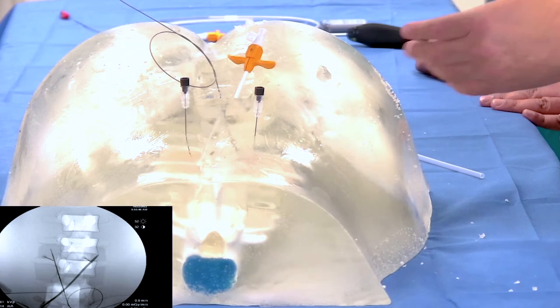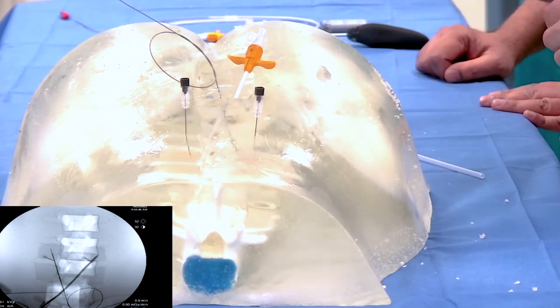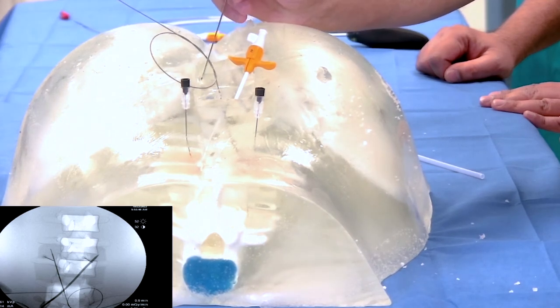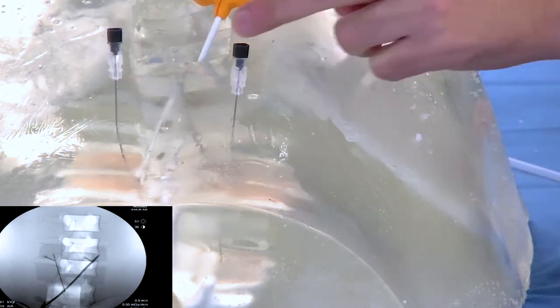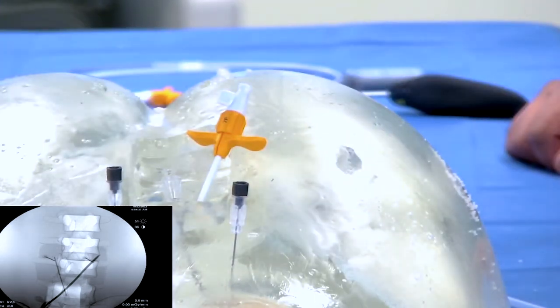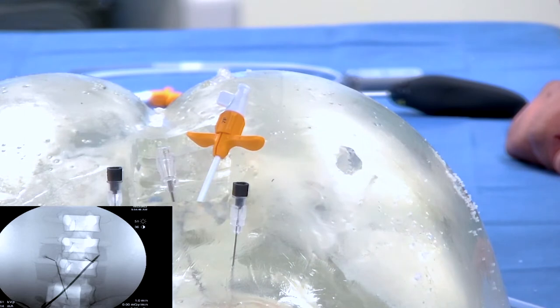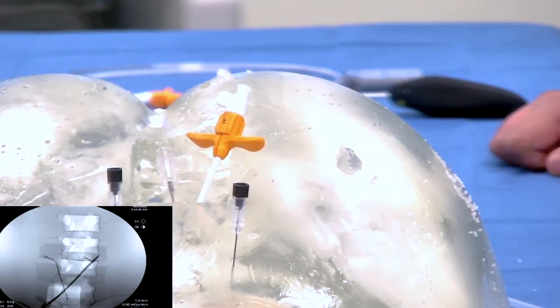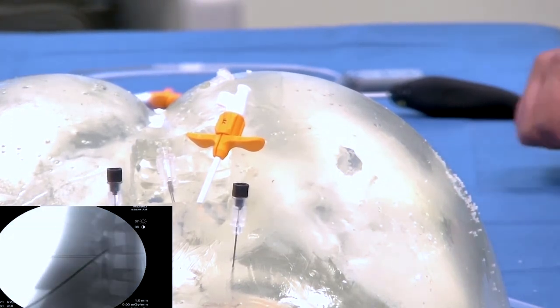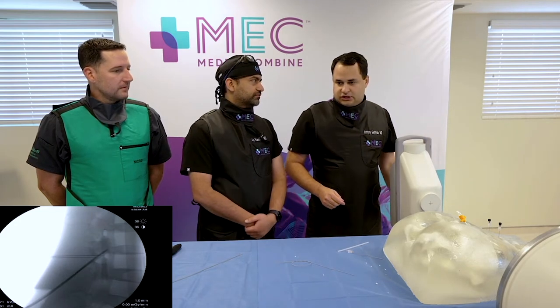Our trajectory goes lateral from the medial line at the spinous process. This is a straight needle — there's no bent angle to utilize — so you have to have a perfect trajectory. Take your time doing this. The procedure is the needle placement in my mind. If you get the needle in the correct location, everything else goes very nicely. We want to aim right at the inferior border of L2 — the posterior inferior border of the vertebral body. You can see our two blocking needles at the top; we want to go right into that border.